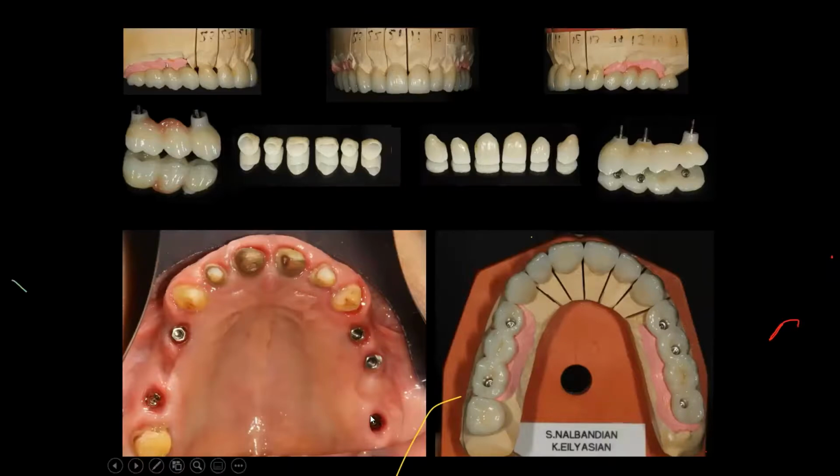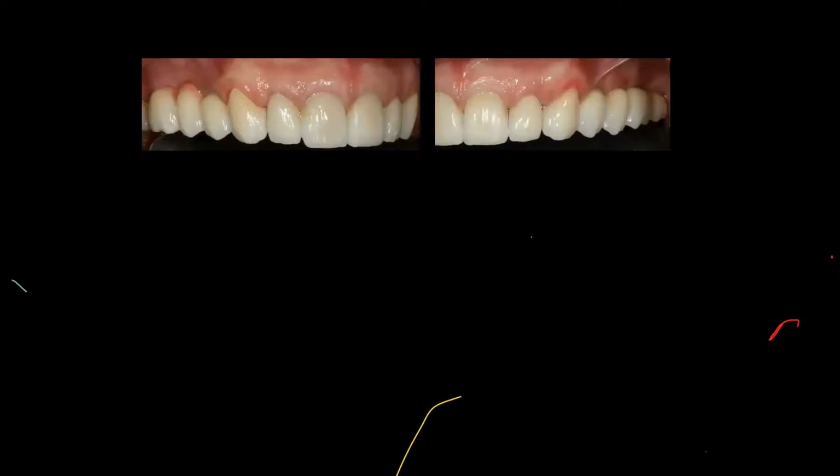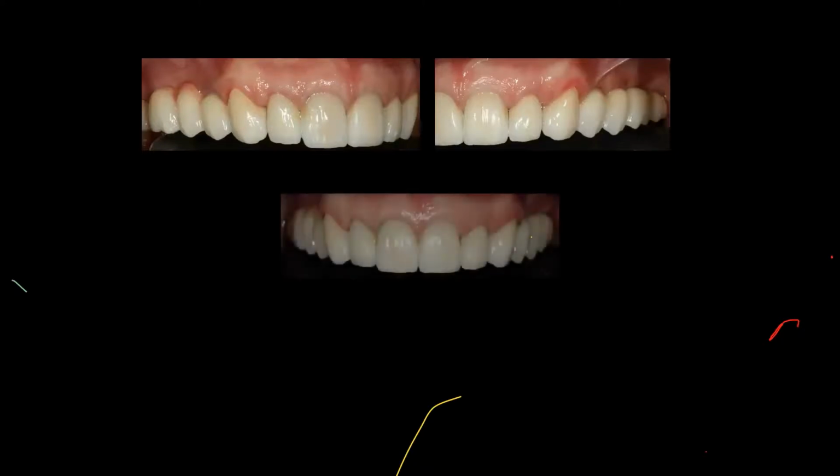You can see the tuberosity implant here is quite big. That's very normal. I'm very happy with the initial outcome. Here's the result. This is the initial cementation that was removed. That's why there's a slight redness there. So I think there's a good aesthetic integration looking through orally.